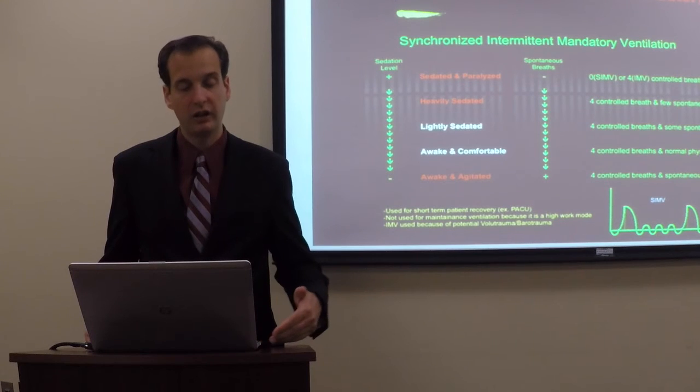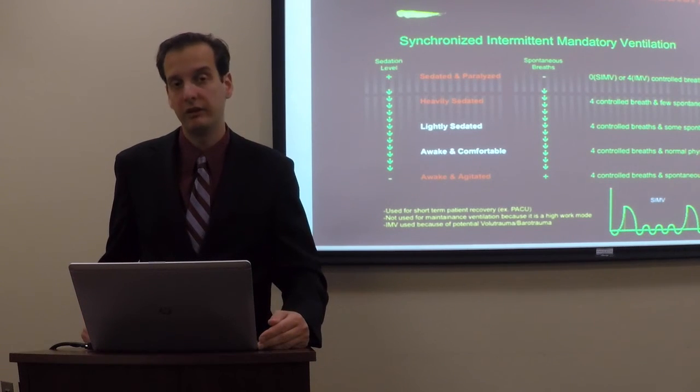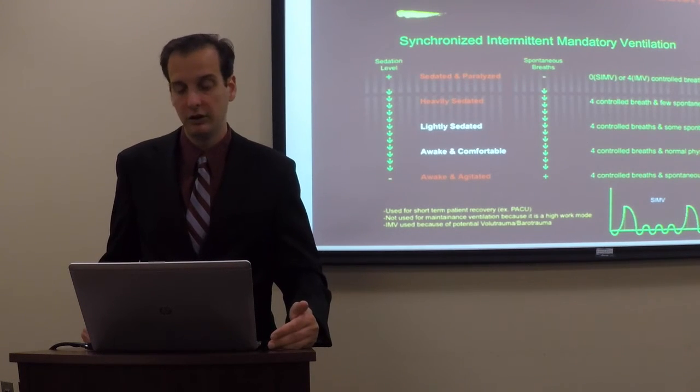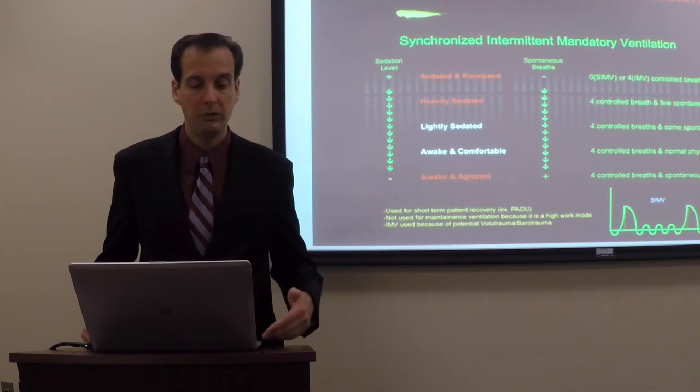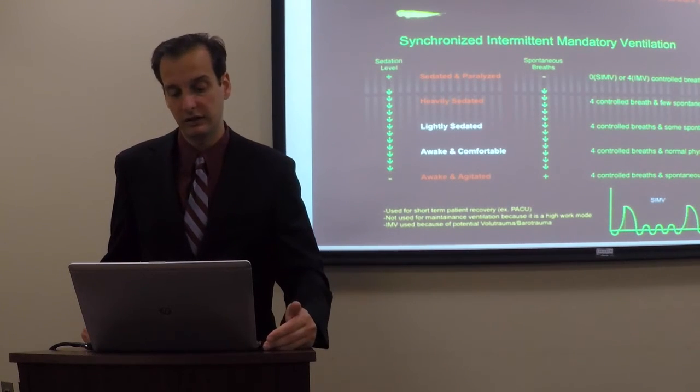In this case, if you were to hyperventilate, you could still obviously breathe above the set rate. However, not every breath attempted by the patient would correspond to a mechanical ventilated breath. So the hyperventilation would be somewhat less.